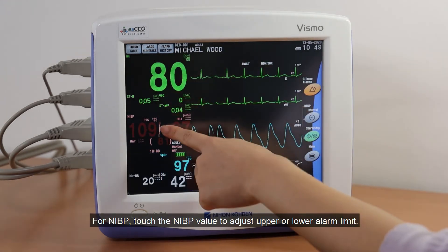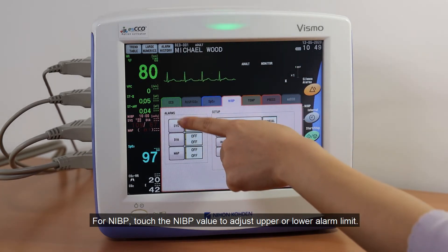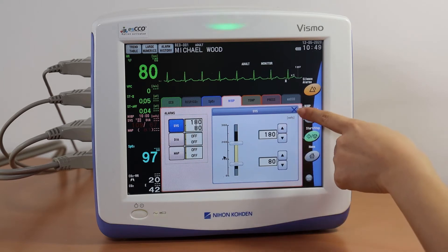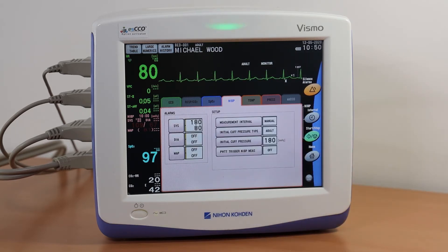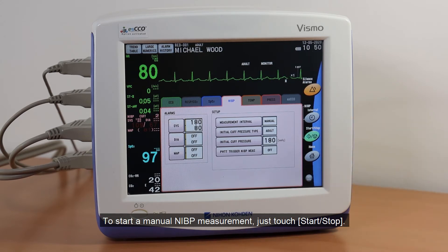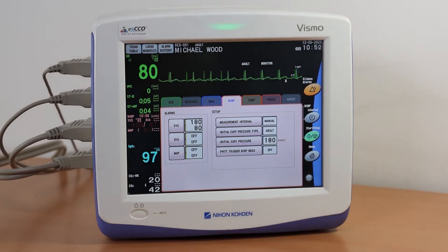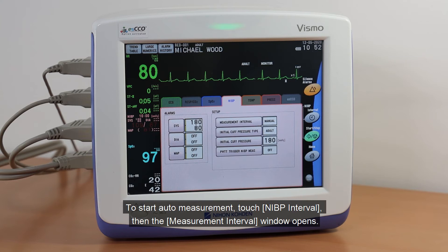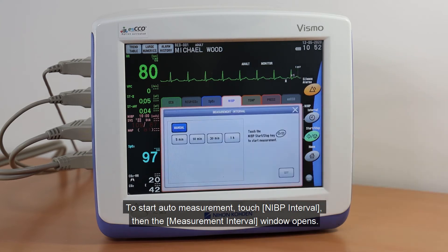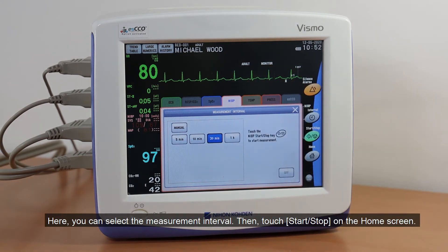For NIBP, touch the NIBP value to adjust the upper or lower alarm limit. To start a manual NIBP measurement, just touch Start-Stop. To start auto-measurement, touch NIBP Interval. The Measurement Interval window opens, where you can select the measurement interval. Then touch Start-Stop on the home screen.